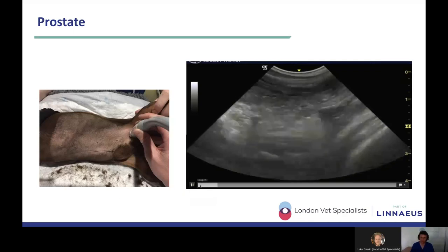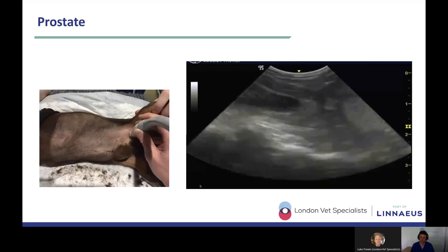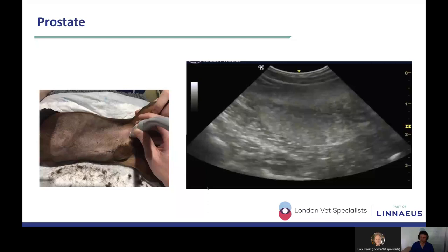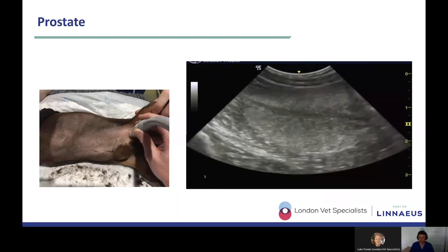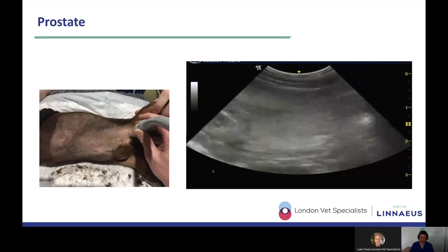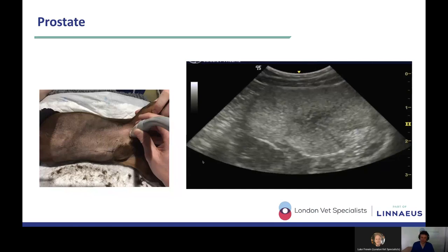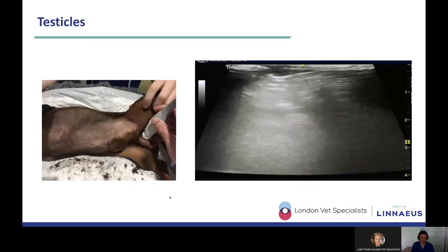So again, probe on the caudal part of the abdomen, midline, sliding caudally. We're trying to tease out the trigone and the urethra. So very subtle fanning movements to try and tease out that trigone and urethra, sliding a bit further caudally as far as you can go to try and fix that prostate. And then once you've got it in long axis, I've just rotated my probe there to get into short axis, and then you can slide cranially, slide caudally again in short axis, making sure that you've shone that ultrasound beam right the way through all of that prostatic parenchyma. You can be confident that you've done a comprehensive ultrasound examination of that prostate.